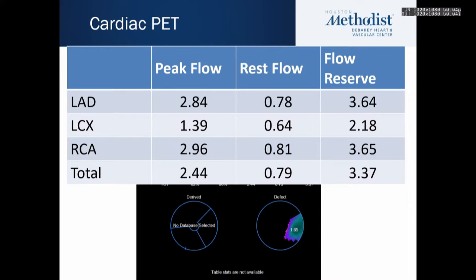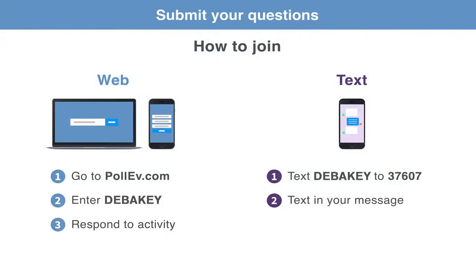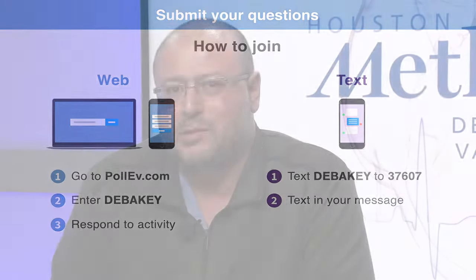So meanwhile, what do you think, Dr. Nabi? I mean, we have a patient who has a perfusion defect in the lateral wall. Her ejection fraction is not bad. Her calcium score is not that abnormal. In fact, in one vessel that we are concerned about, there are no calcifications detected. And the biggest question now, is this real? Is this an artifact? What quality assurances do we have to ensure before calling a defect there?